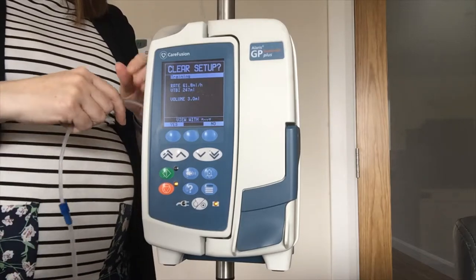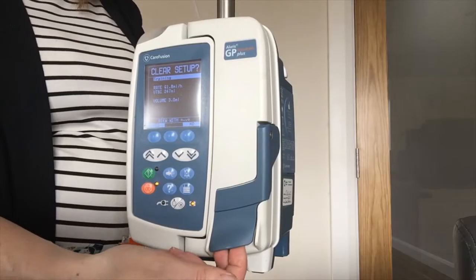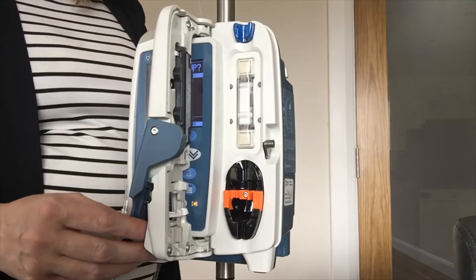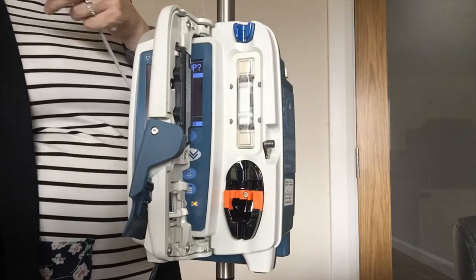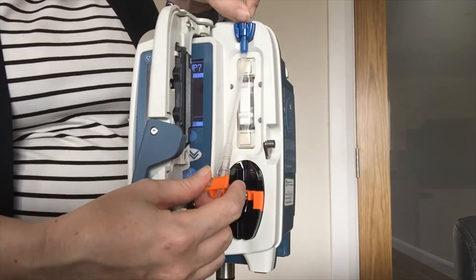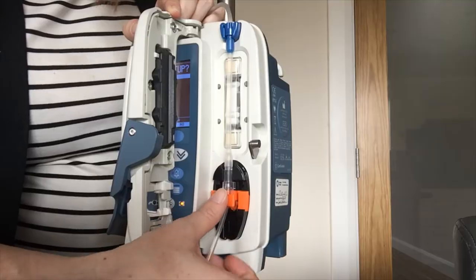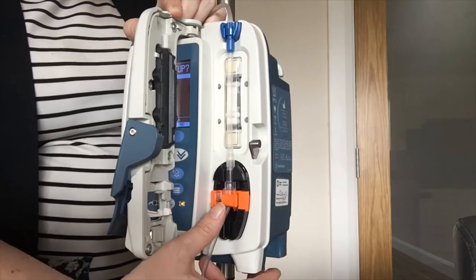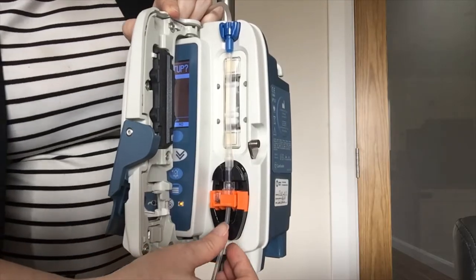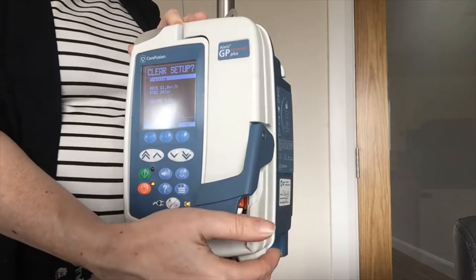Loading of this pump is super easy. You are just going to pull on the handle of the door — there is a little groove here that you can pop your fingers into. Pull that gently and inside you will see it is colour coordinated: the blue of the set with the blue of the pump, and the orange with the orange. The sticky-out bit of the clamp pops into the pump — you hear a little click as it goes in — and then your line goes down in between the two pieces of plastic. This is also where your air and line sensor is. Lift the handle of the door, bring it back over and close it down.